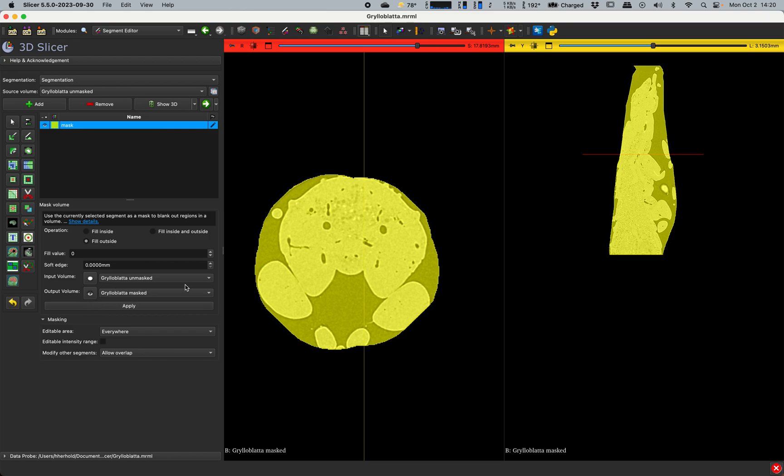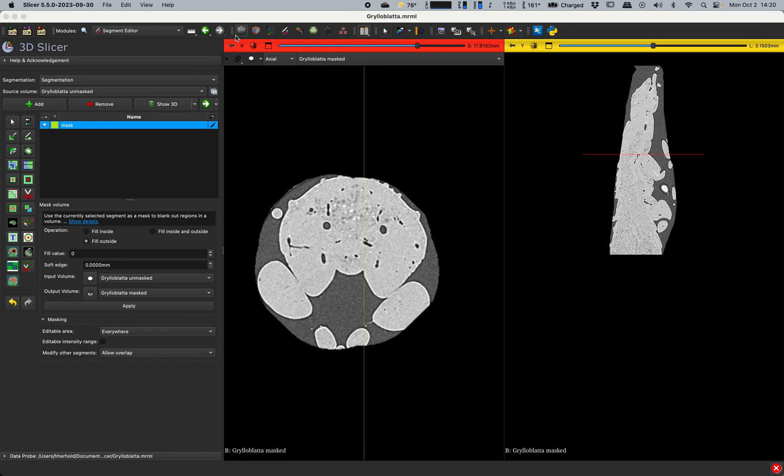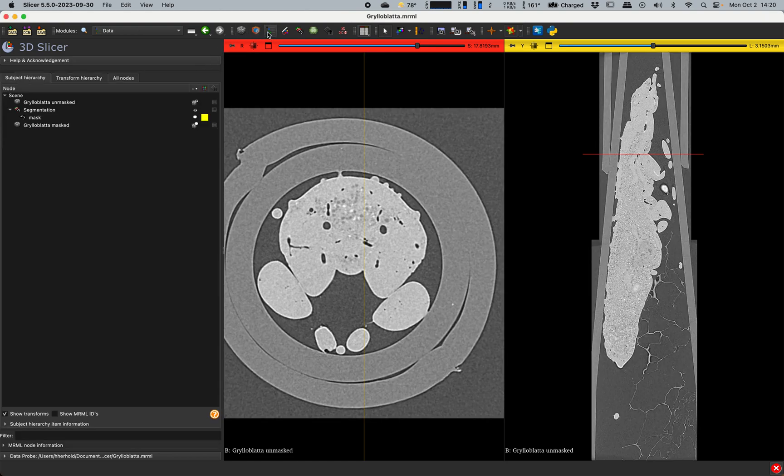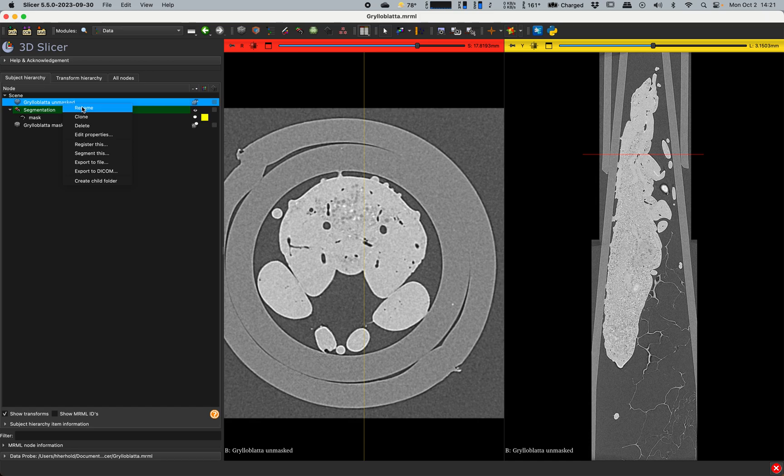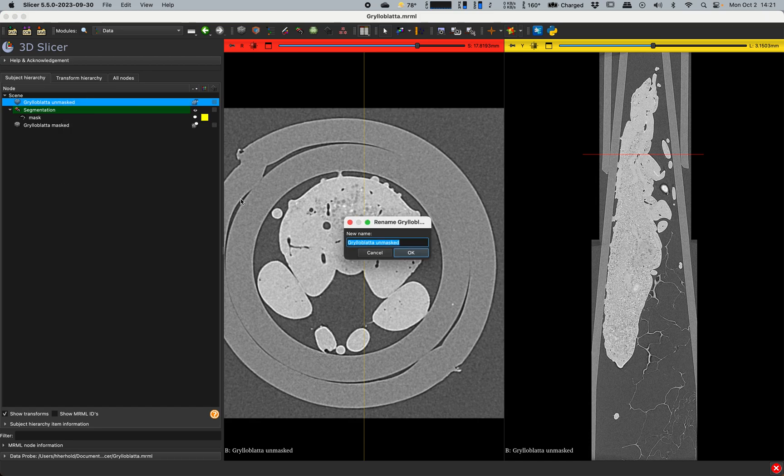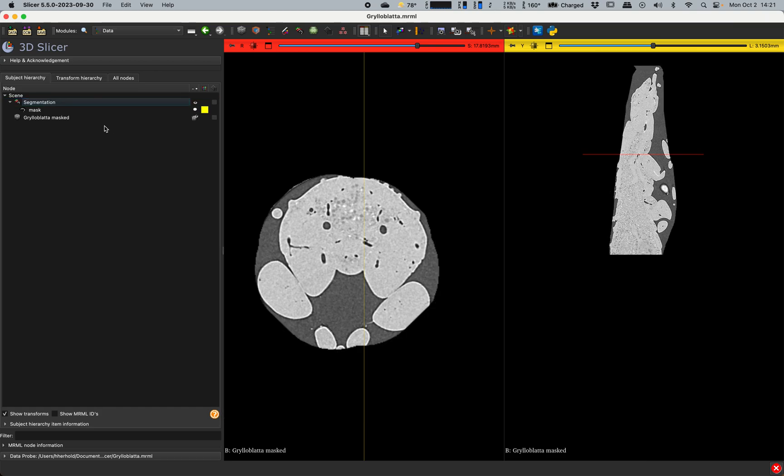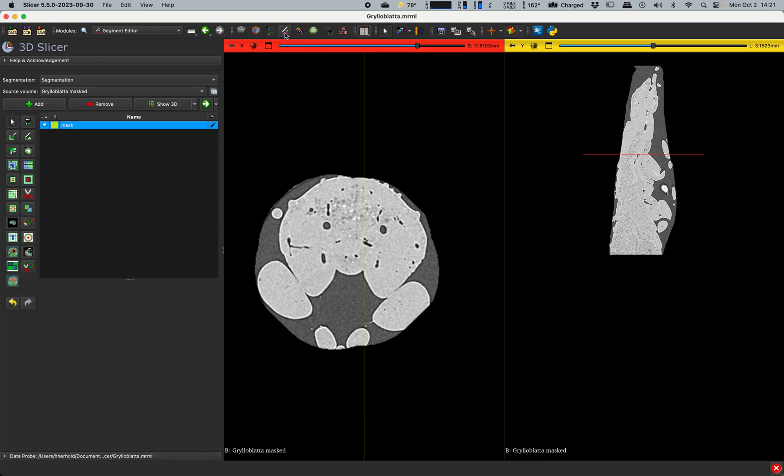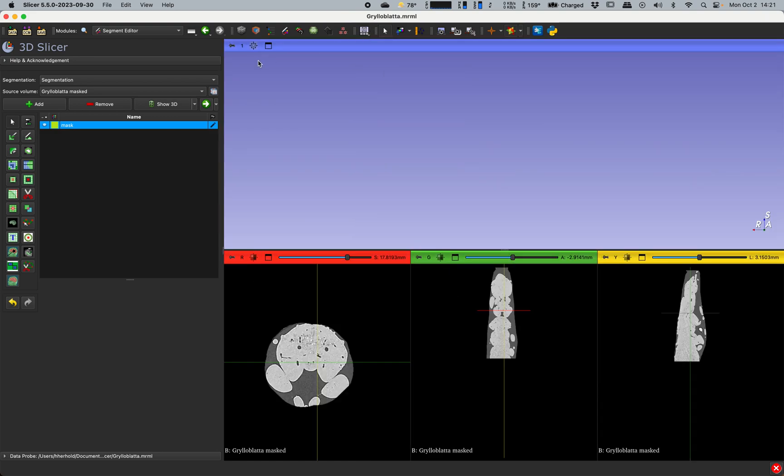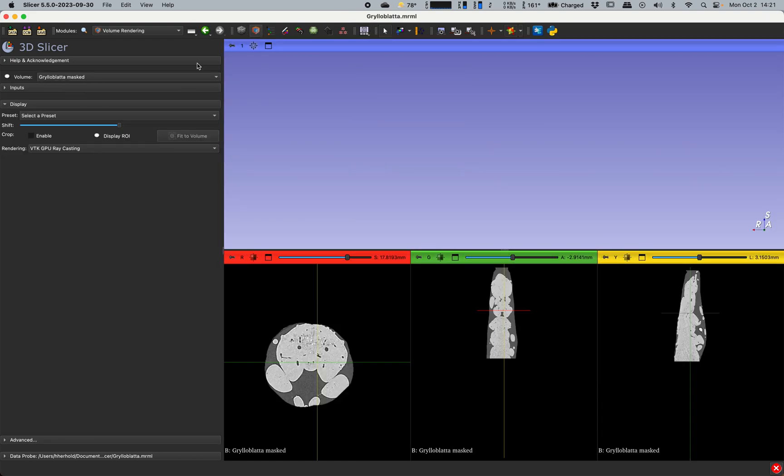And this has now masked off everything that we don't want to see. So if we go to data module here, we've actually got two things. We've got unmasked and masked. So now I don't want to rename it. I want to delete it. So now we've just got the mask volume. And just to kind of verify that we can sort of see what we want to see or that it did what we wanted it to do, we will very quickly go to the volume renderer and take a look at it.